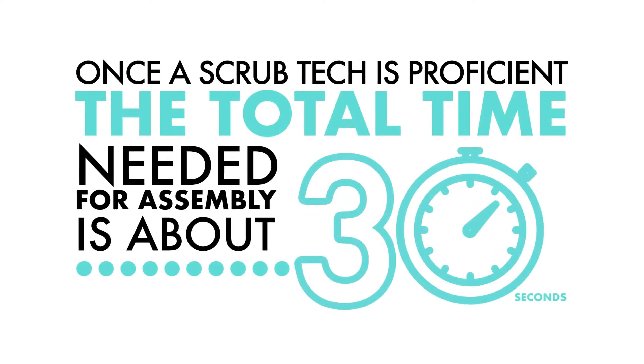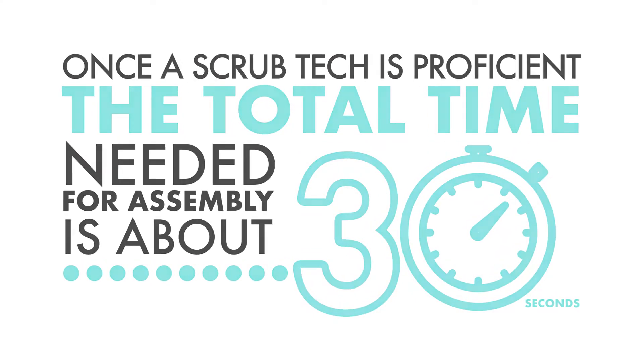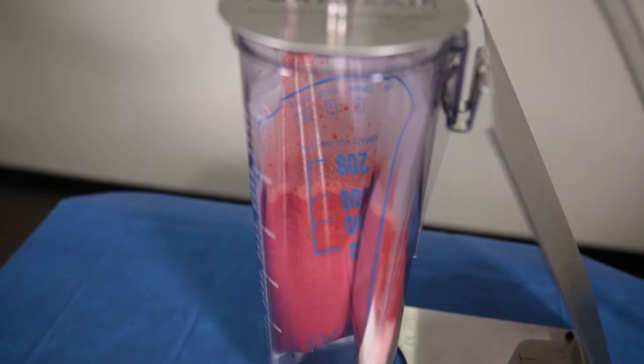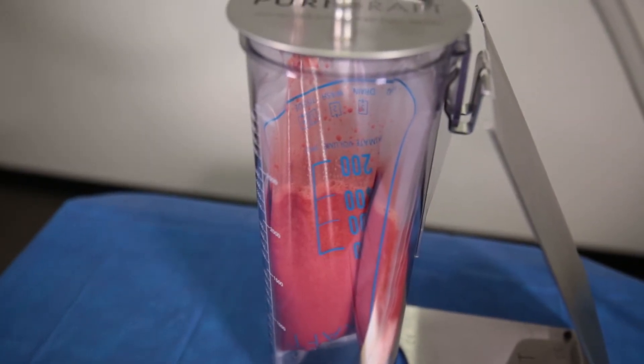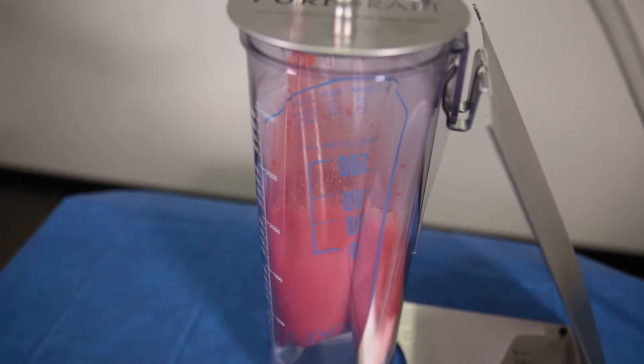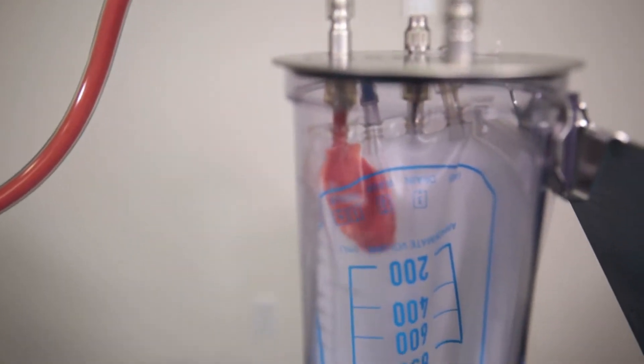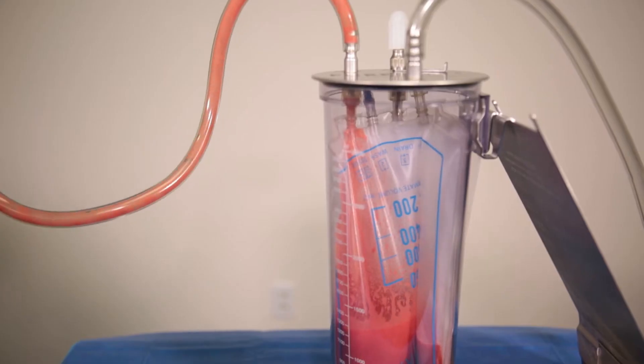Once a scrub tech is proficient, the total time needed for assembly will be about 30 seconds. During the harvesting process, the PureGraft 850 bag may expand from time to time when the cannula is removed from the patient. This is normal. As one can see, the system has been assembled properly and fluid is not leaking from the patient port.